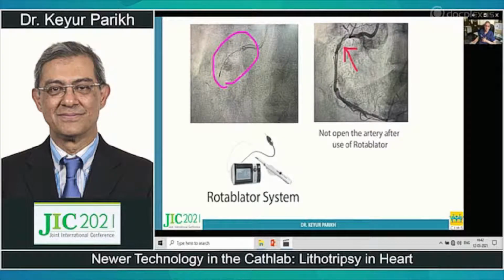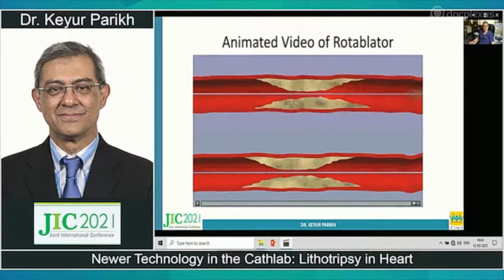Rotablator is a diamond-coated burr, which rotates at a very high frequency, rotations per minute up to 150,000, which I've been using for over 25 to 30 years. And despite that, it didn't open well.